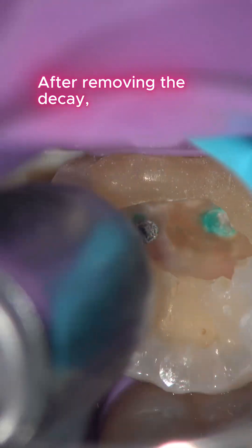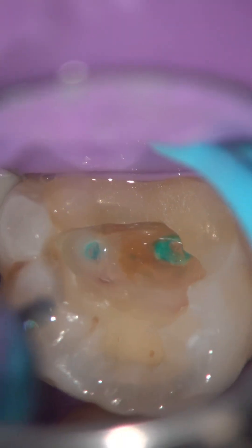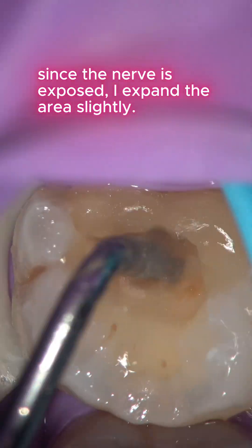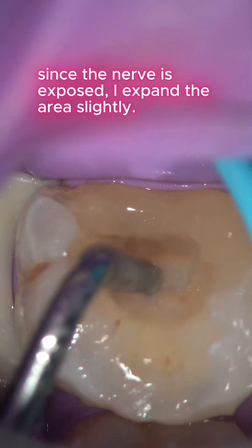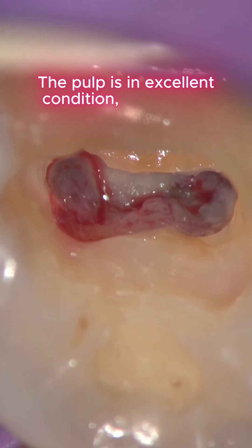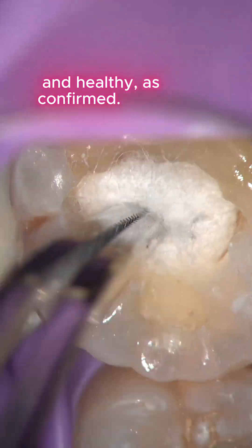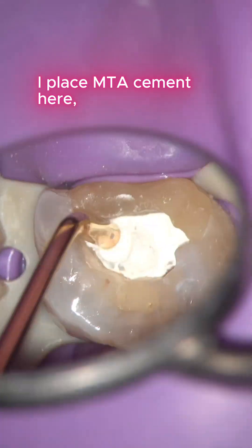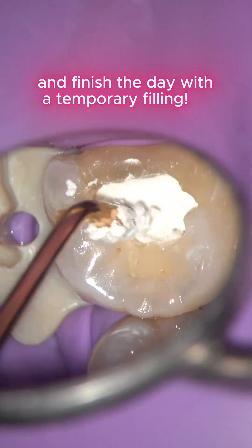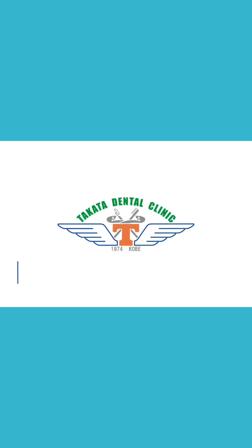After removing the decay, since the nerve is exposed, I expand the area slightly. This is the pulp nerve. The pulp is in excellent condition — alive and healthy. I place MTA cement here and finish the day with a temporary filling.